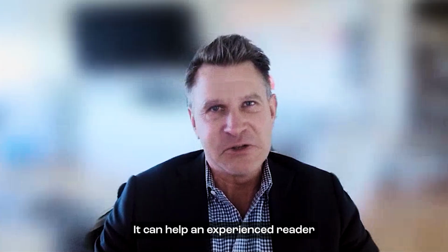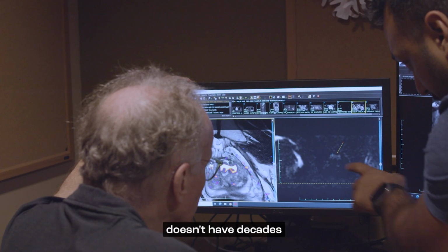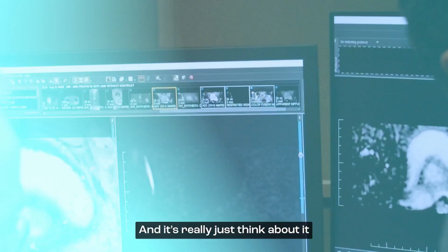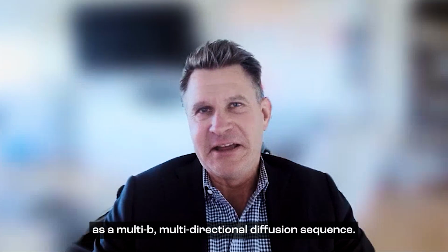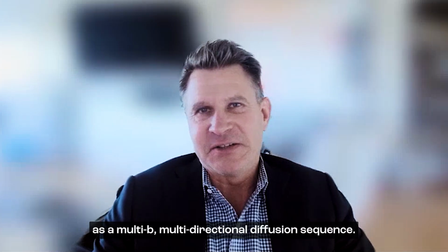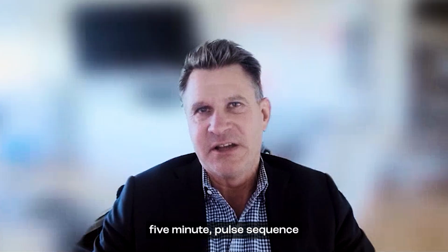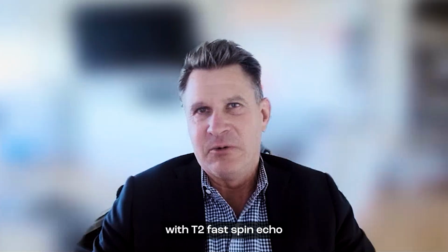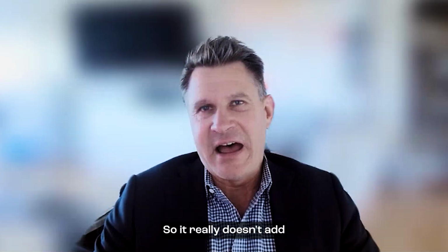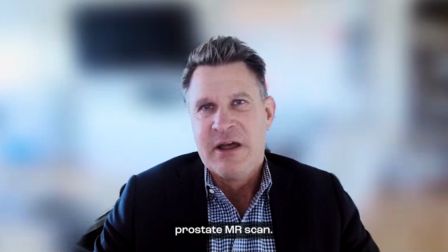It can help an experienced reader like myself, and in practices where maybe the reader doesn't have decades and decades worth of experience reading prostate MR. Think of it as a multi-B, multi-directional diffusion sequence. It's a very short 5-minute pulse sequence, and it can be readily integrated with T2 fast spin echo, turbo spin echo. So it really doesn't add time to a traditional prostate MR scan.